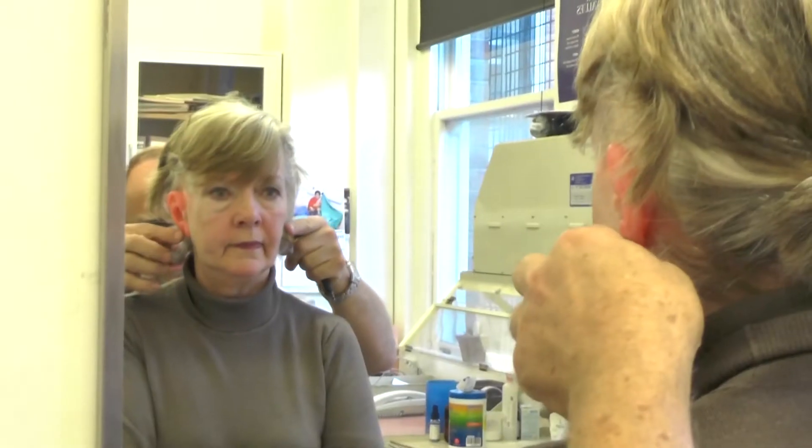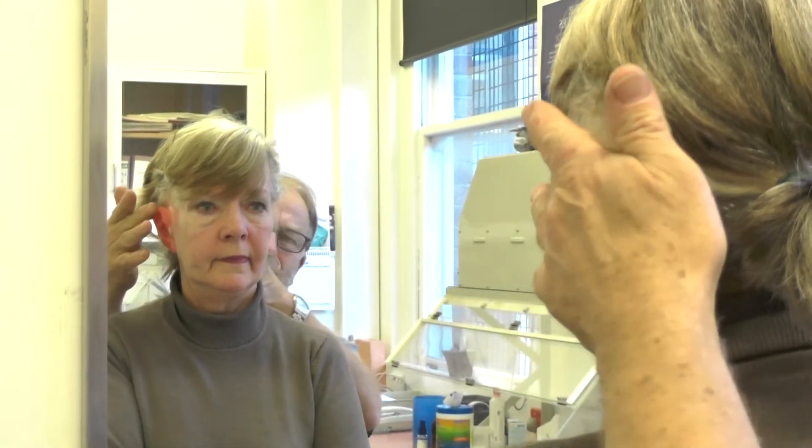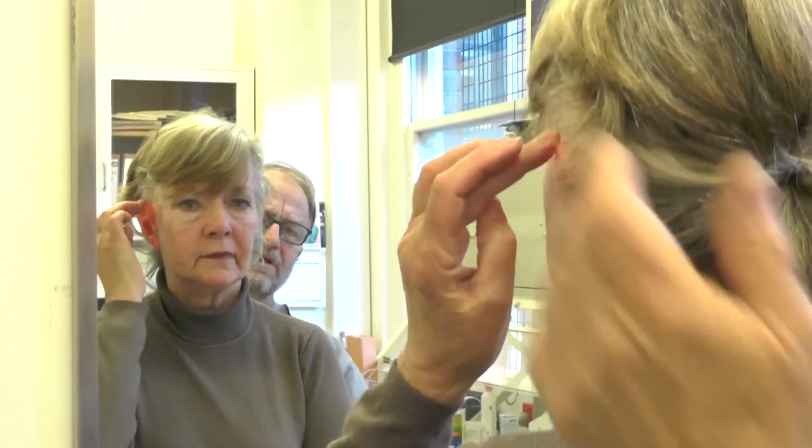It clanks into place. Wow. Alright, simple as that. I'll add a little bit on the bottom here just to match this bit, and I think I need to take that in a little bit, just here.